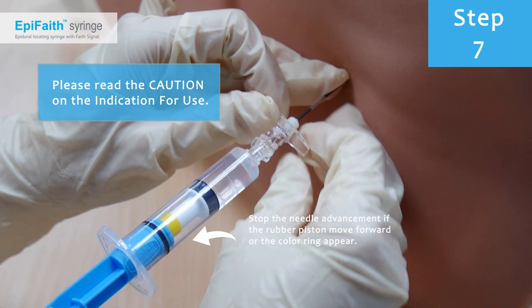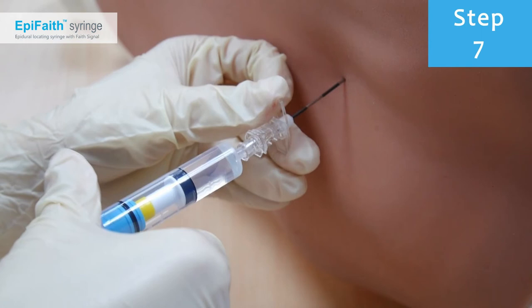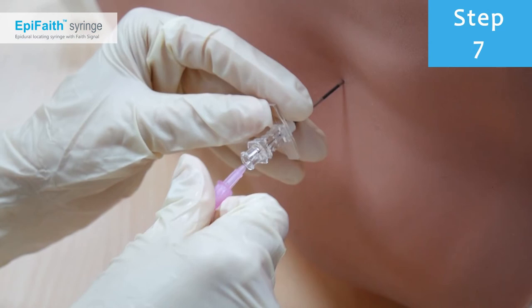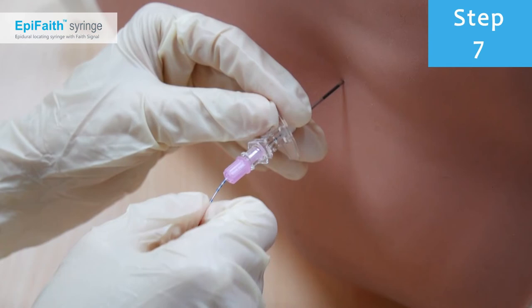Stop needle advancement if the rubber piston moves forward or colour ring appears, as loss of resistance has occurred or if the system is open. Ensure needle tip location even if the warning signal appears, and insert a catheter to reaffirm location.